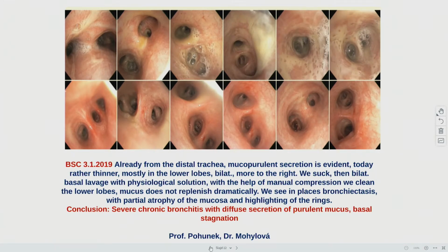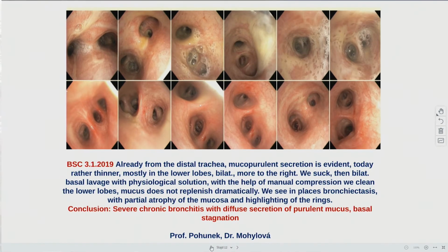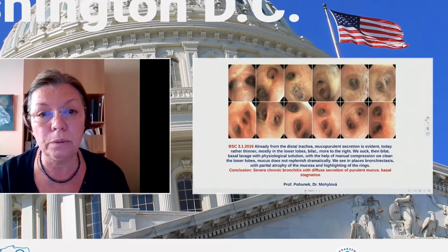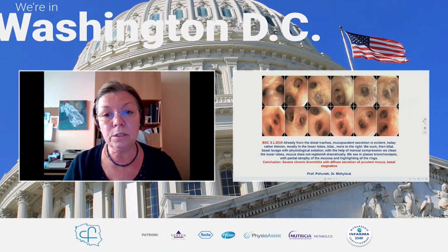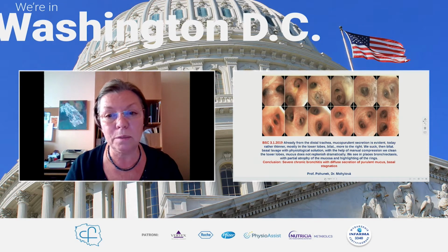It is from January 3rd, 2019. She spent Christmas and New Year at home, and she absolutely ignored ACT. Yeah, you can see how damaged the airways, full of mucus, full of purulent mucus, are. So what to do with this case? Next slide, please.